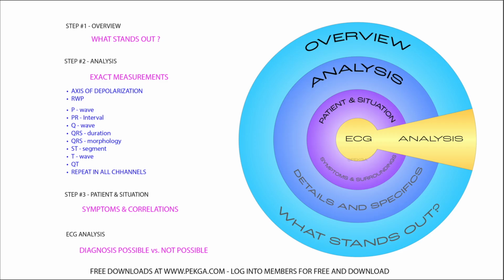Now, before we get into it, just a reminder, you really should be thinking about forming your own method, whatever that is, something that helps you get through an ECG. What we do here is we have a three-step approach that we rely back on. Sometimes you're tired, you just don't know where you stopped. You can use your method to get you back on the right path.